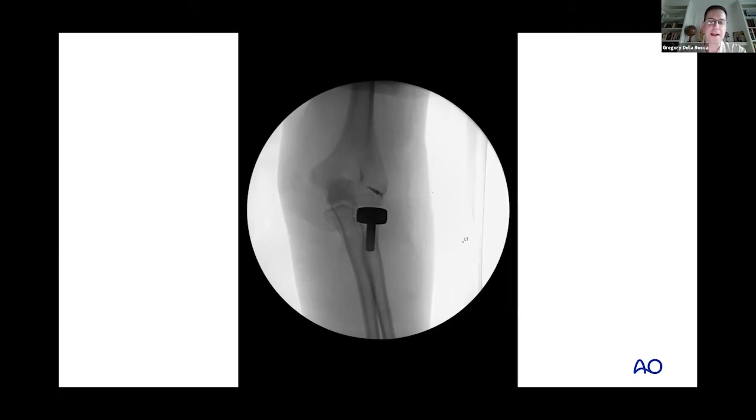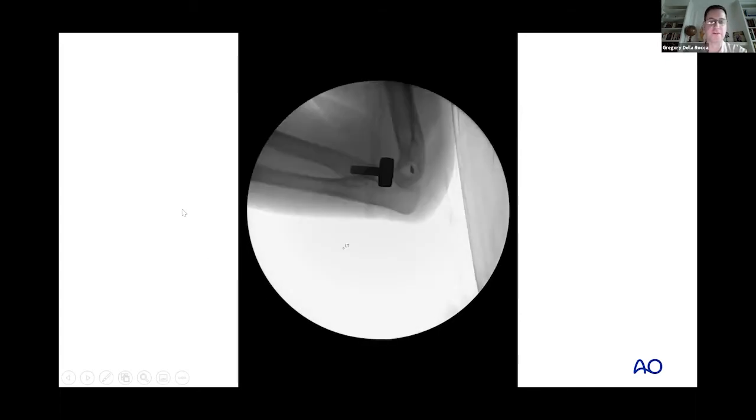And then I'll put my anchor into what I believe to be the isometric point at the capitellum and pass sutures through the remnant of the lateral collateral ligament and tie. Only when I'm ready do I tie everything down. And then I basically close the skin and hope that everything's stable. And in this guy, I did not need to do a separate medial approach, just like Jonah has indicated, probably not going to be needed.